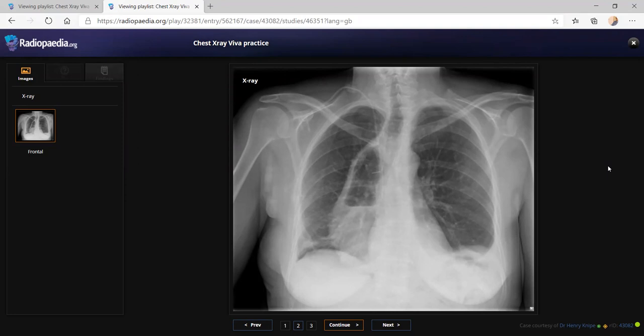There is a large dilated air fluid level seen in the right paravertebral region, which is not obscuring the heart border. There's some element of left lower lobe collapse also seen. So I'd like to correlate with the previous history of the patient, if the patient has any surgical history. Your patient had a previous surgery. You can see the surgical clips there. Okay. So in that case, I'm thinking of the possibility of a gastric pull-up with anastomosis.